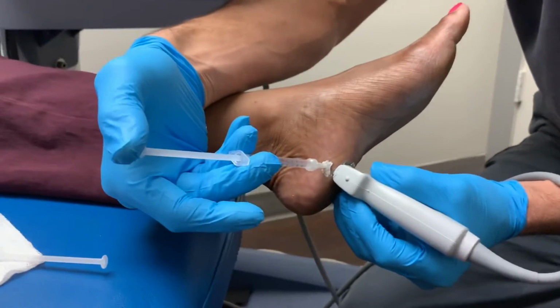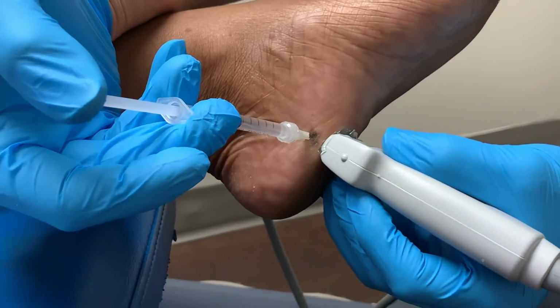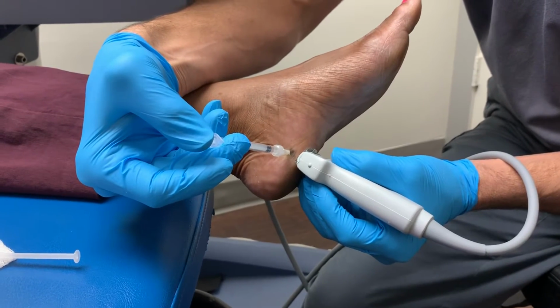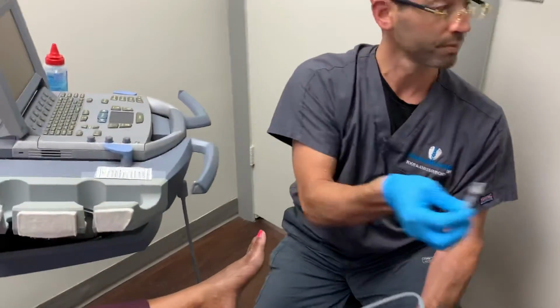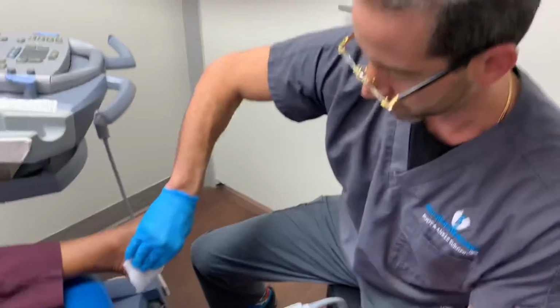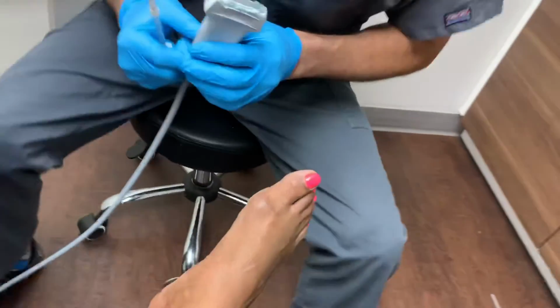And now we're gonna tell the patient that they're gonna feel a lot of burning. And again, I know a lot of people that like to really just infiltrate this as quick as possible. I personally don't, and we're done there. Just like that. Nice and slow. We'll put that right over there. The patient is smiling at me.